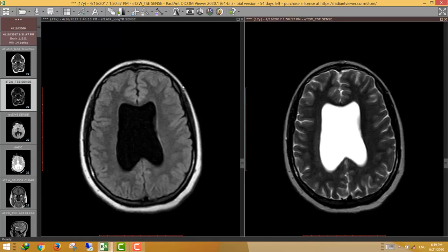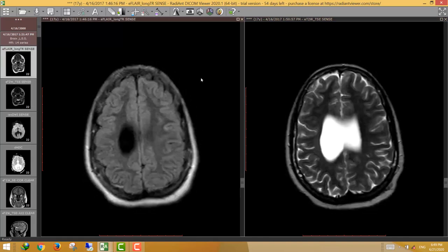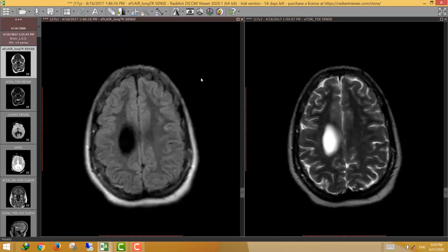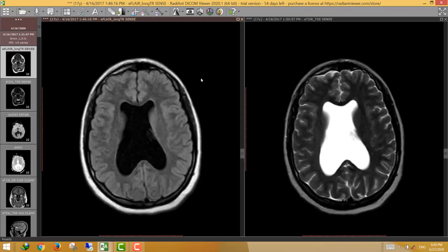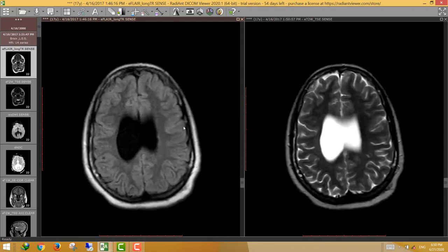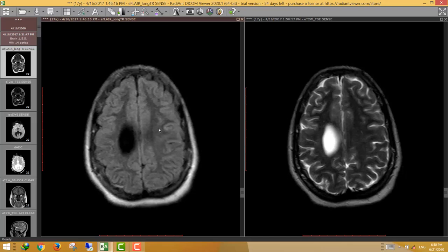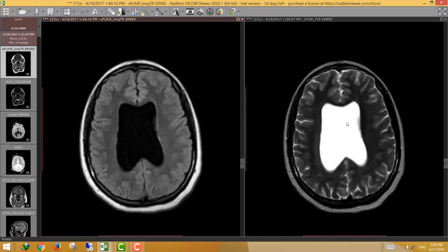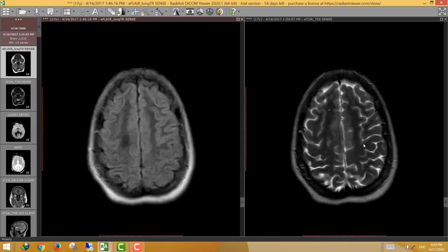This is a 17-year-old male who came for MRI brain. These are the FLAIR and T2-weighted images for this patient.